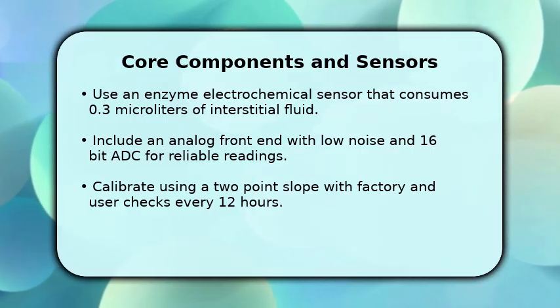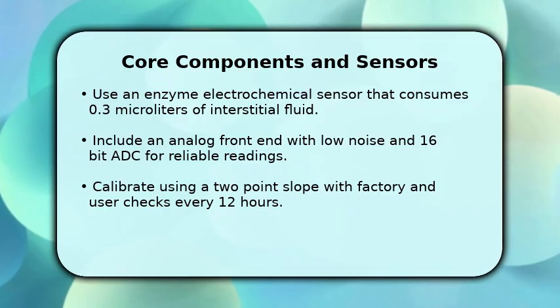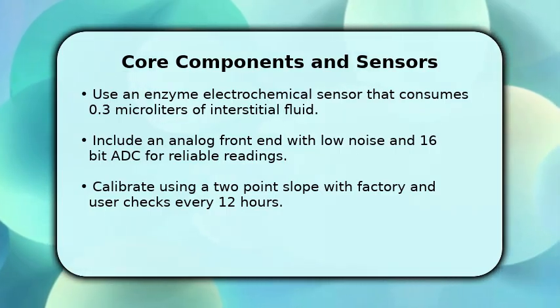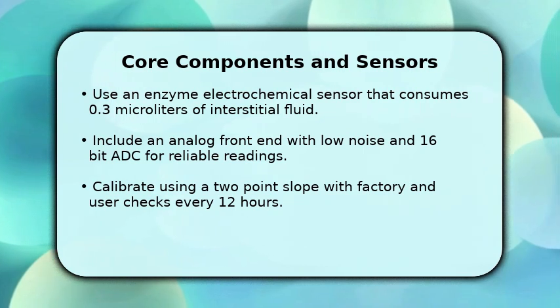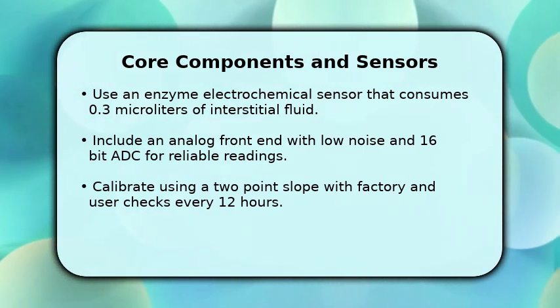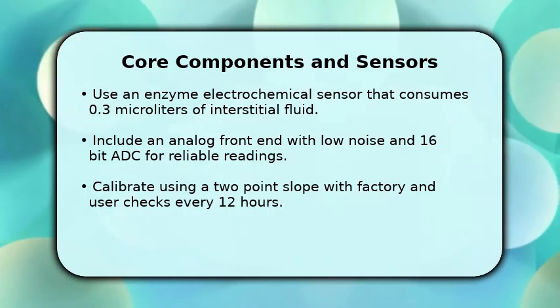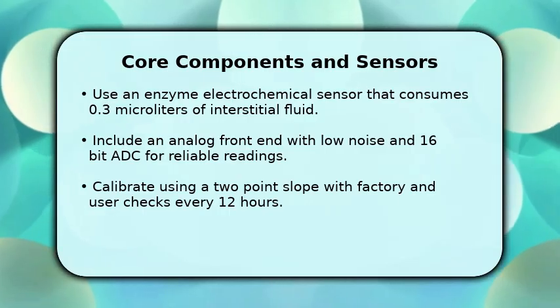Include an analog front end with low noise and 16-bit ADC for reliable readings. Implement firmware with filtering and temperature compensation to reduce drift. Calibrate using a 2-point slope with factory and user checks every 12 hours. Ensure biocompatible adhesives and sterile packaging for the sensor assembly.